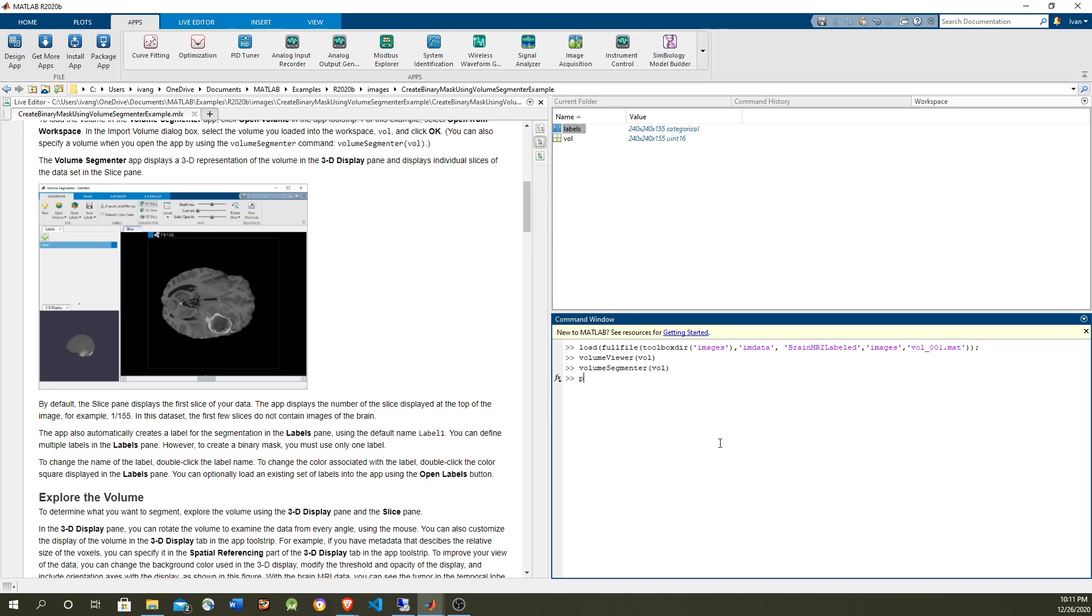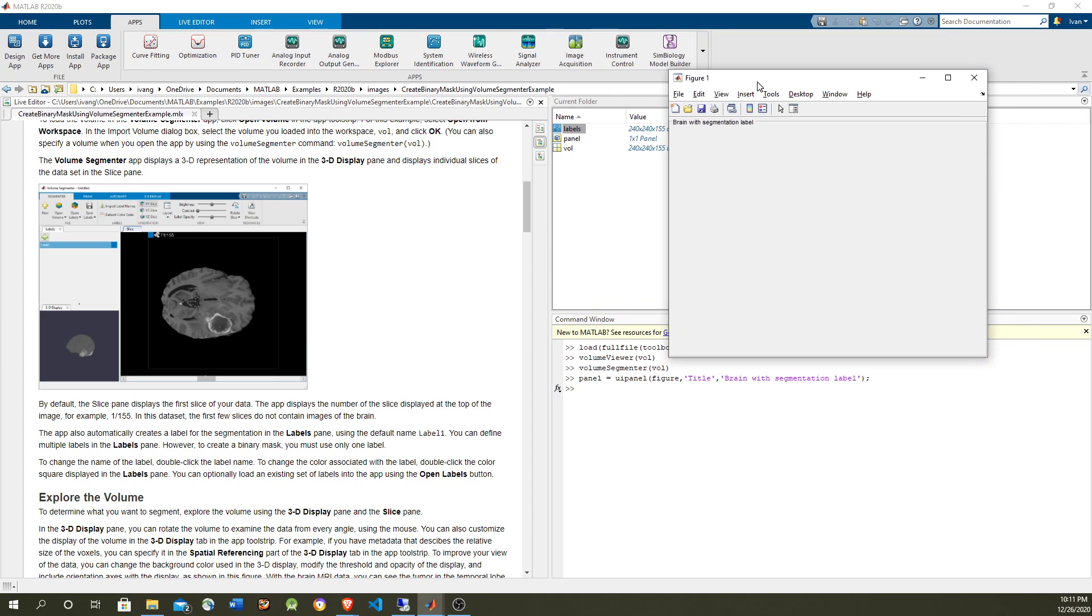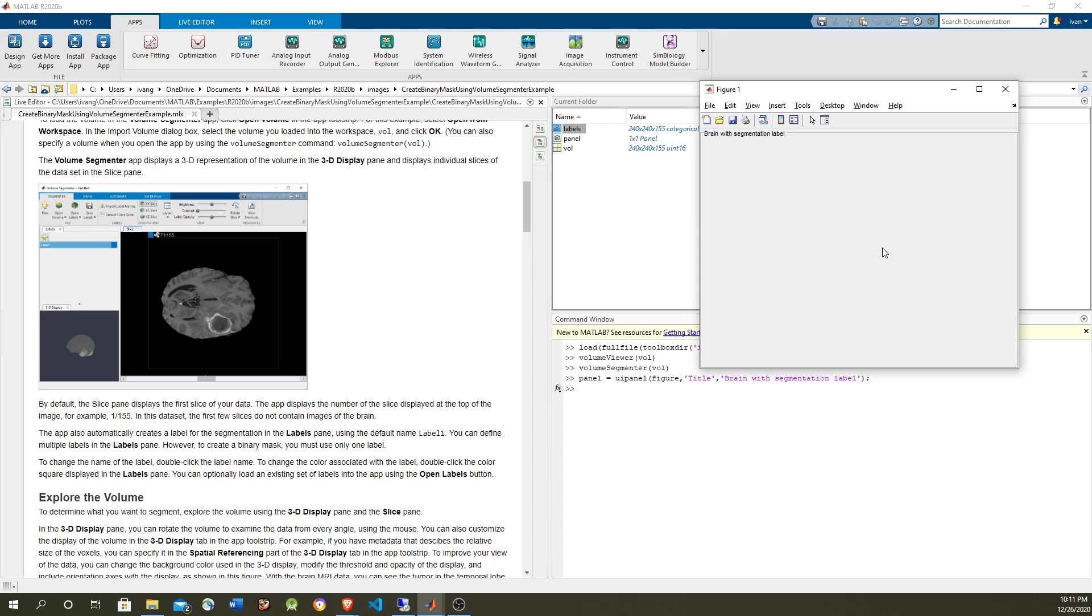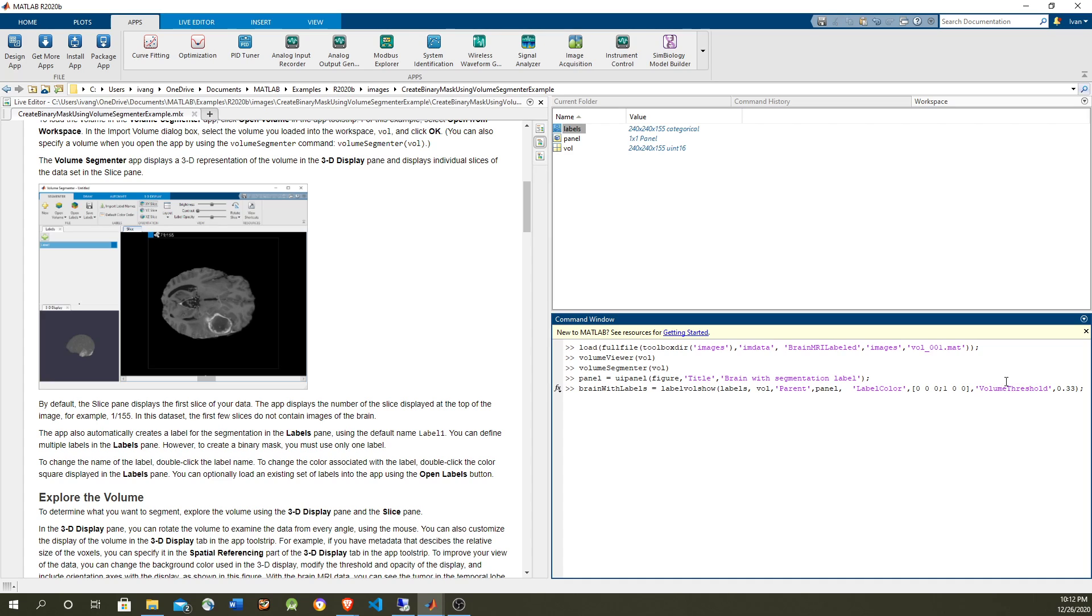So now let's visualize it. Let's use a UI panel which is a figure, and we're going to display the image there. We're going to overlay the labels with the volume and we're going to put a transparency of 0.33 to the volume labels, because otherwise the volume is going to cover the whole tumor and we're not going to see it. So we're going to use this 0 and red as the label color map.